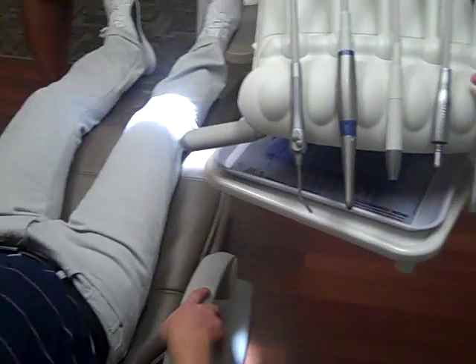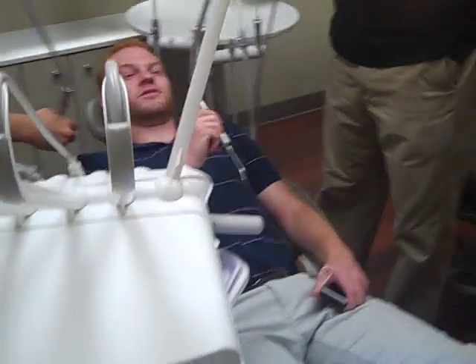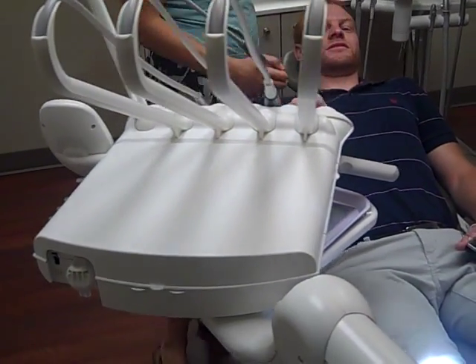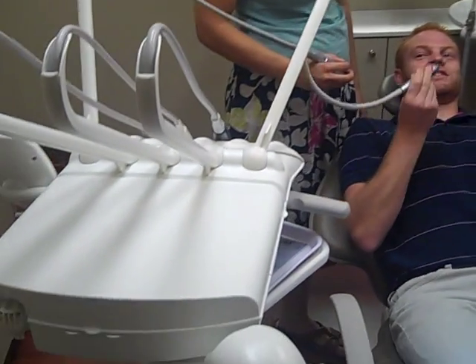Your eights — is that what you guys call them? Eights, yeah. Oh, this is weird to have it from the top. See, when you pull it, it stays. There you go. That's kind of weird, though. But I don't think you'd have it that close. No, I don't think you'd have it. That's awesome, though. Yeah, see — it stays. That makes sense.